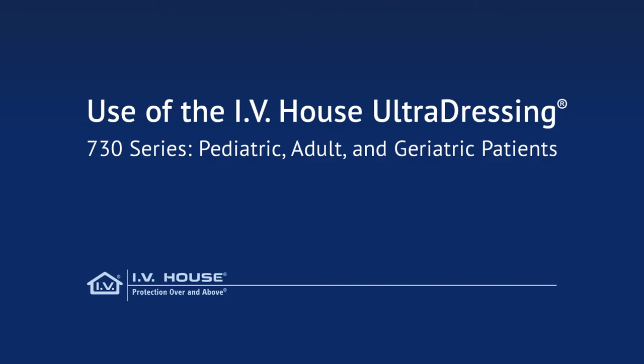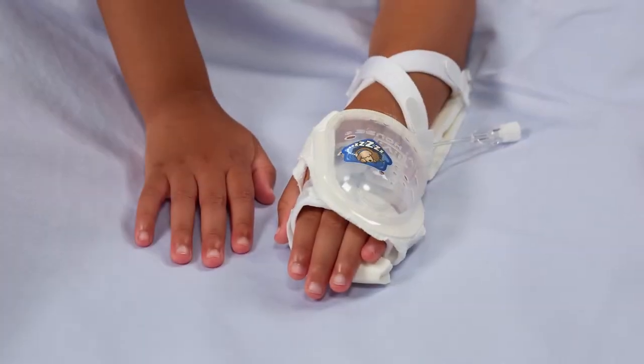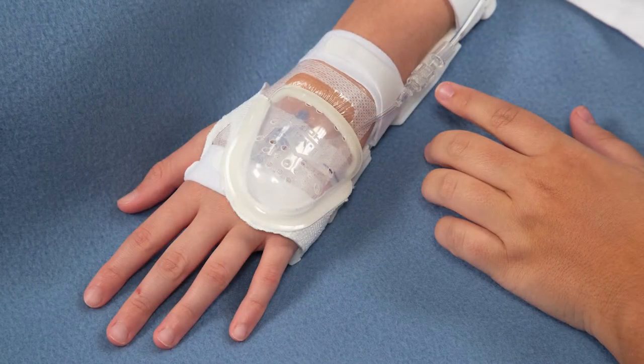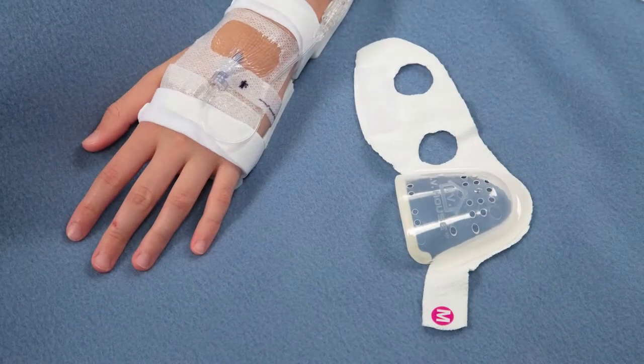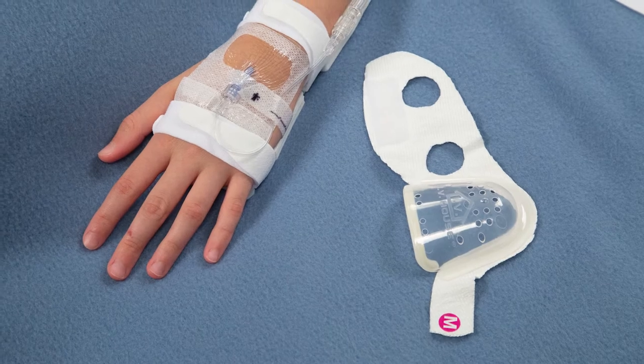The 730 Series IV House UltraDressing is available for pediatric, adult, and geriatric patients. The award-winning design reduces the need for over-taping to prevent damage to delicate skin.